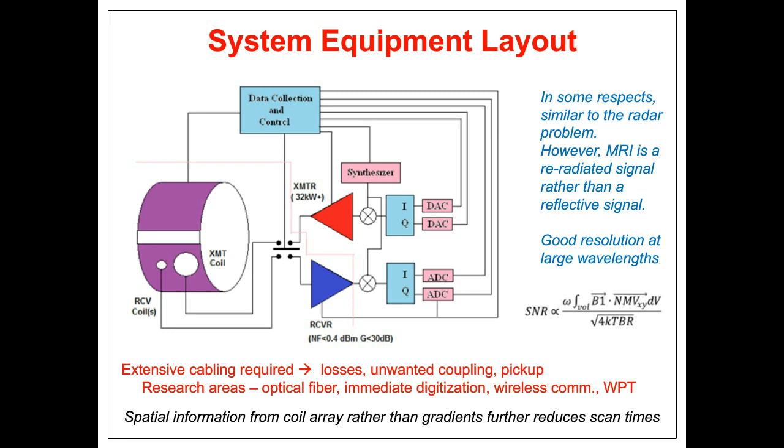Now, here's the thing that really surprised me when I started getting into MRI: the RF transmitter can be transmitting multi-kilowatts of power at HF and VHF. So multi-kilowatts of power, pulsed of course, but a large amount of power is occurring, and that's being absorbed by the human body. So that is a very interesting aspect, because since it's being applied to the human body, the amount of RF dosage always has to be monitored to make sure it does not exceed safe limits.